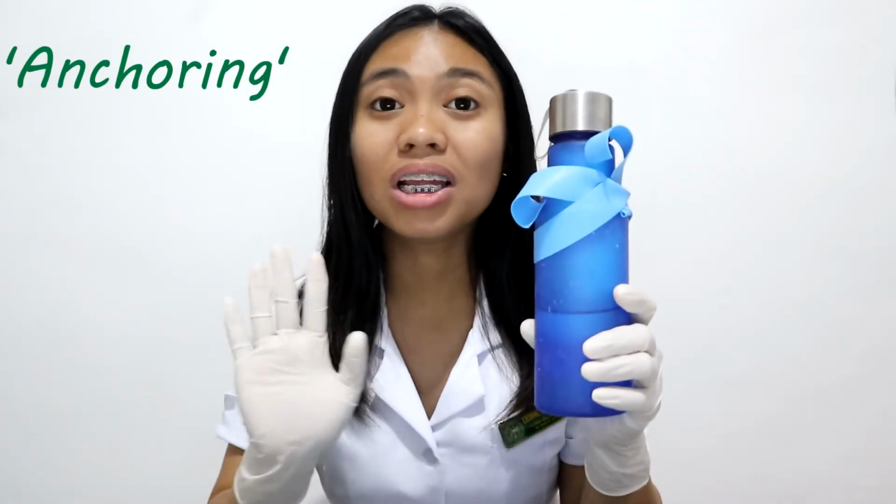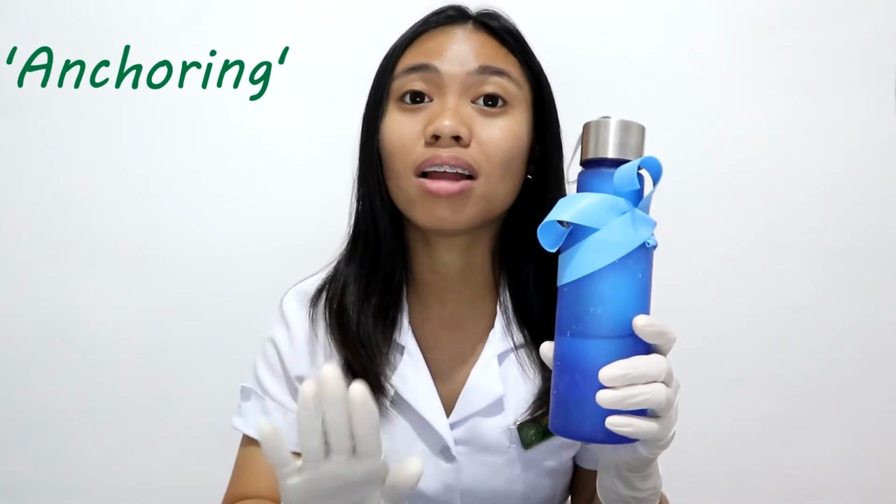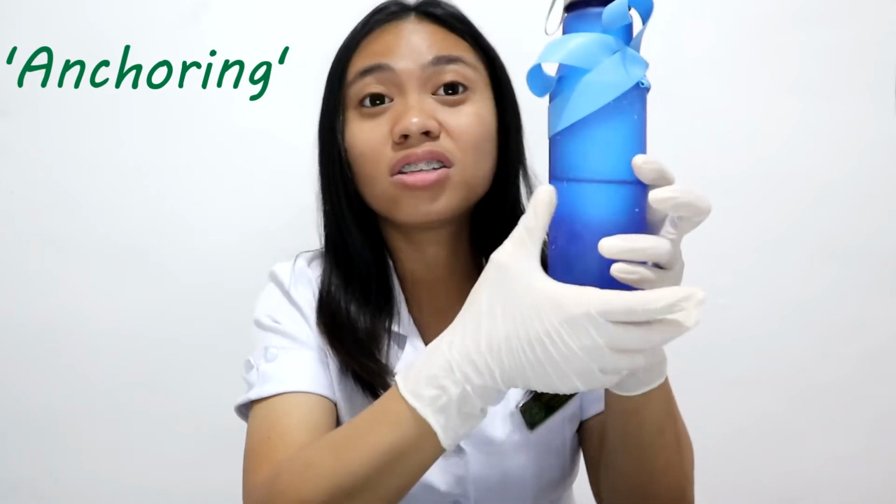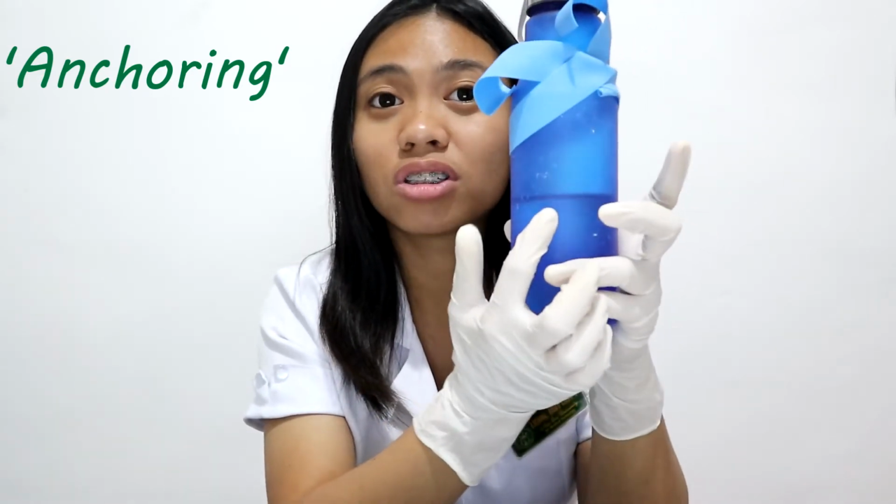Then do what they call anchoring, which means pulling down the skin from below the intended puncture site using the thumb. So if this is the intended puncture site, you should pull the skin downward towards the wrist. So this is used to put the vein in place and prevent it from moving.